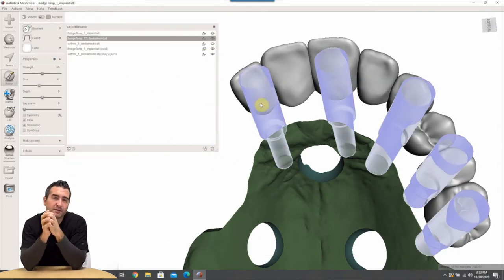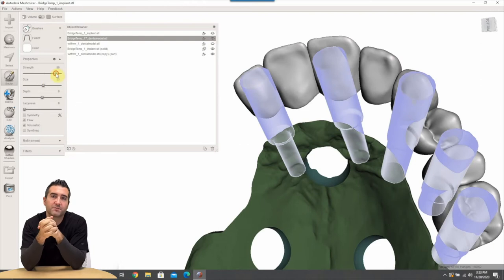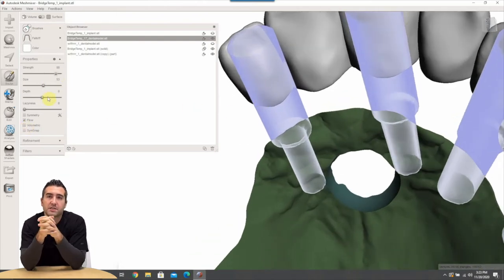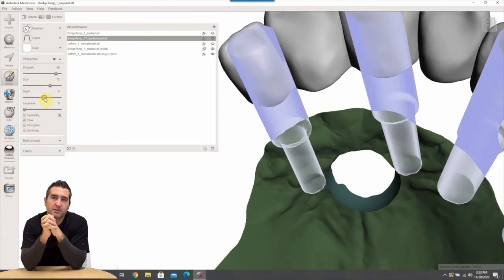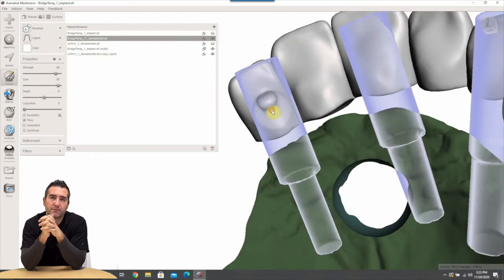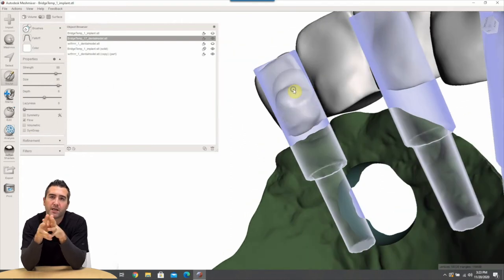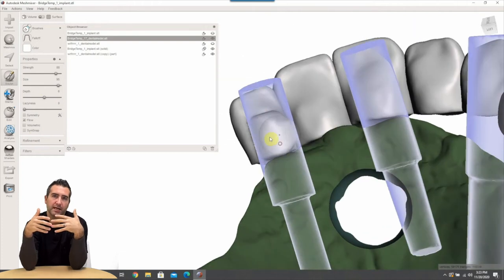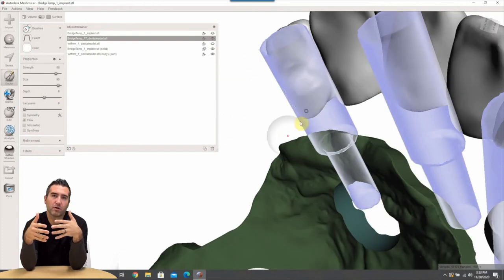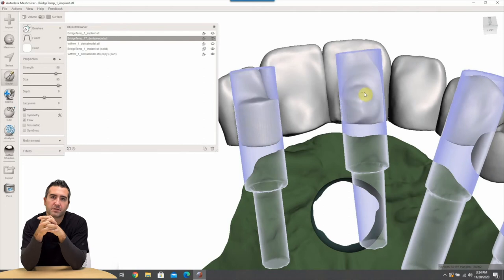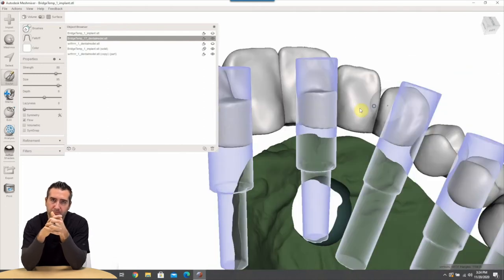So the next thing is, and this probably is an oversight on our part on the wax up, but the linguals are deficient based off of the implant locations. So we're going to go ahead and make the implant extension tubes magnetic and we're going to use the attract tool and we're just going to go ahead and boost those linguals out and they'll go all the way to the most palatal aspect of those extension tubes.